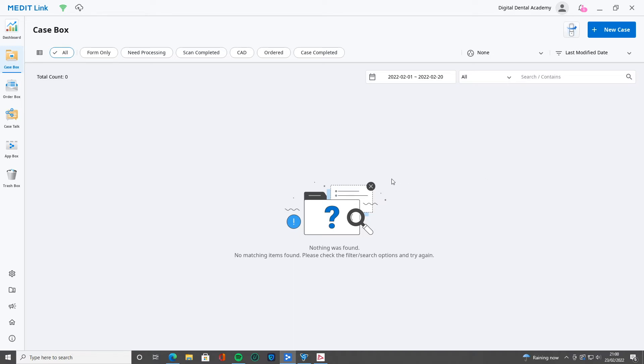But for today, this is just simply about how you set up your partner network. Now, there's obviously a lot of different labs, it's free for labs to sign up to MediLink as well.